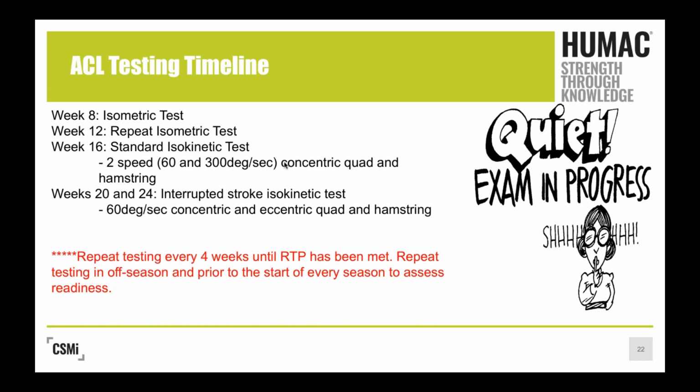John's pitchers that he's had over the years, they all do this as well, not just for ACLs. They come in because they need to know that their rotator cuff is ready to go for that next season. So that's big. Get your athletes in, even if it was 2, 4, 5 years ago. Routine testing to make sure that they're ready to go is really important.